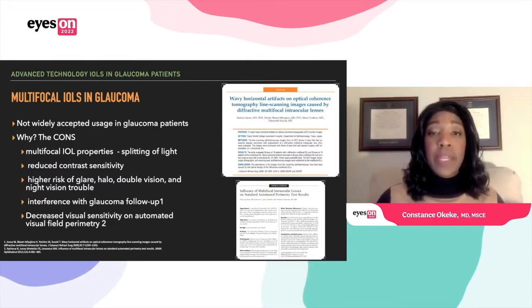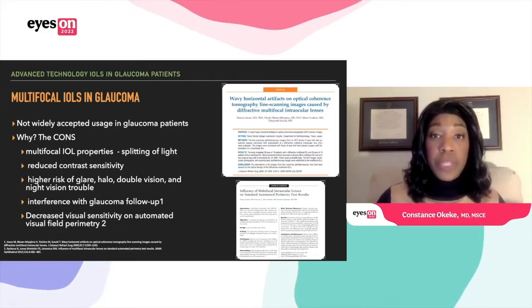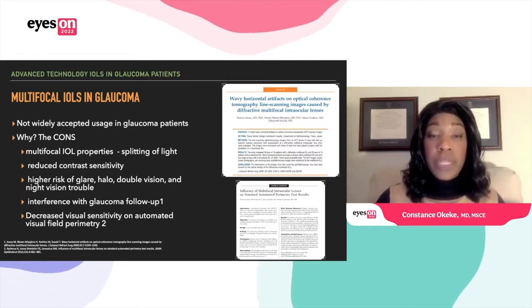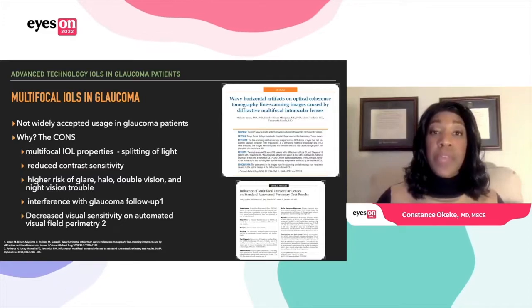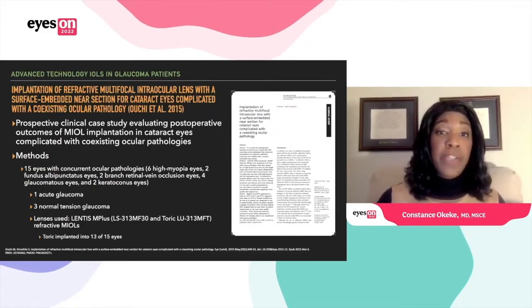And there have been studies that have shown that there can be interference of multifocal lenses with visual field testing, where there's decreased visual sensitivity with multifocal lenses. And then also, sometimes with certain types of OCT technology, there could be artifacts that can compromise the results. So these are things that are important to be thinking about with our glaucoma patient population.